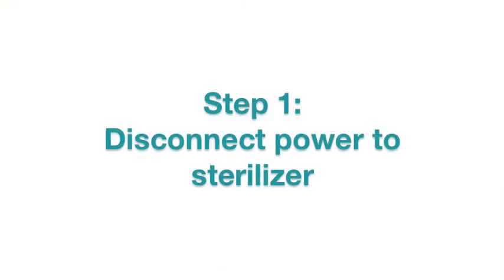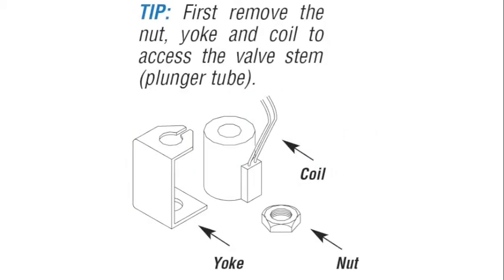Our first step will be to disconnect the power to the sterilizer by unplugging the power cord. Never rely on just the power switch. If you disassemble the solenoid valve with the power on, you can cause damage to the valve coil.